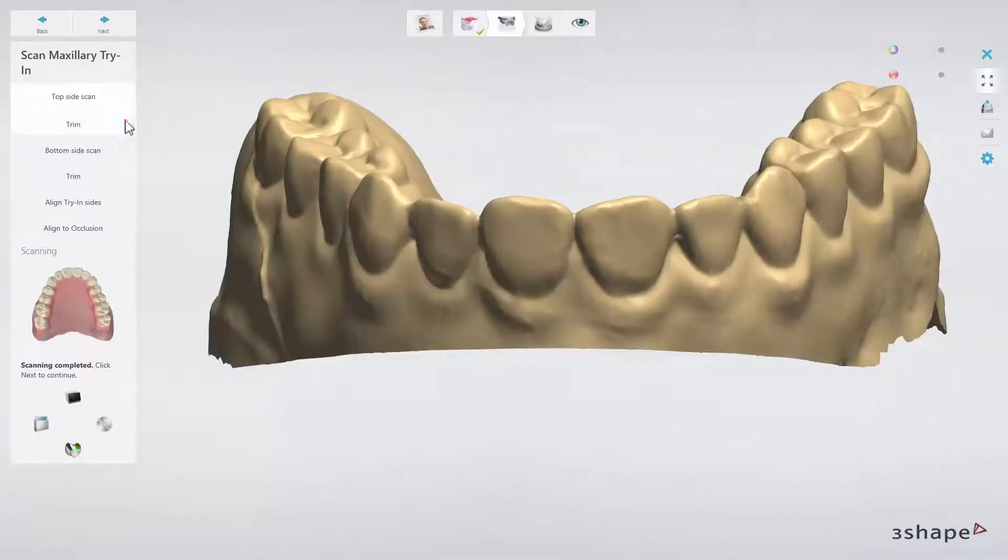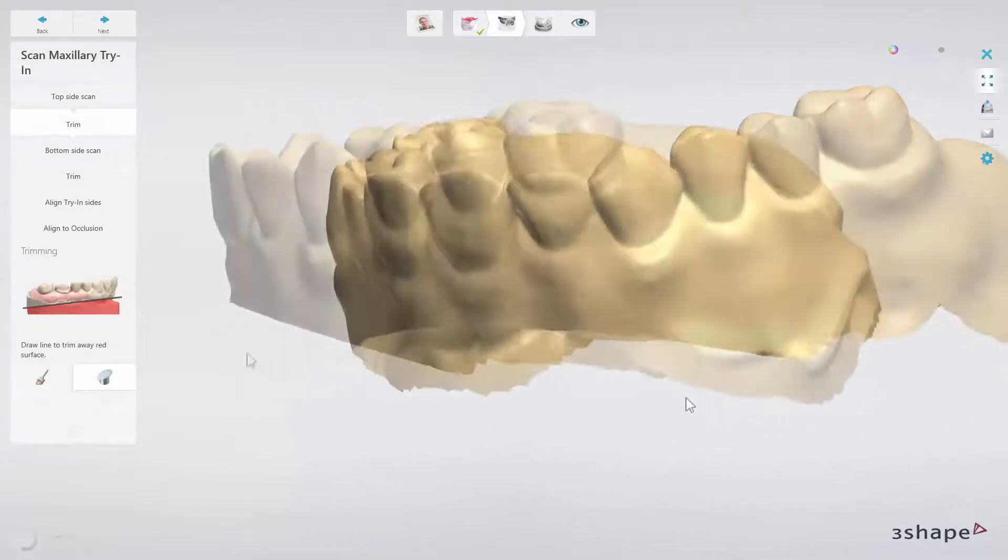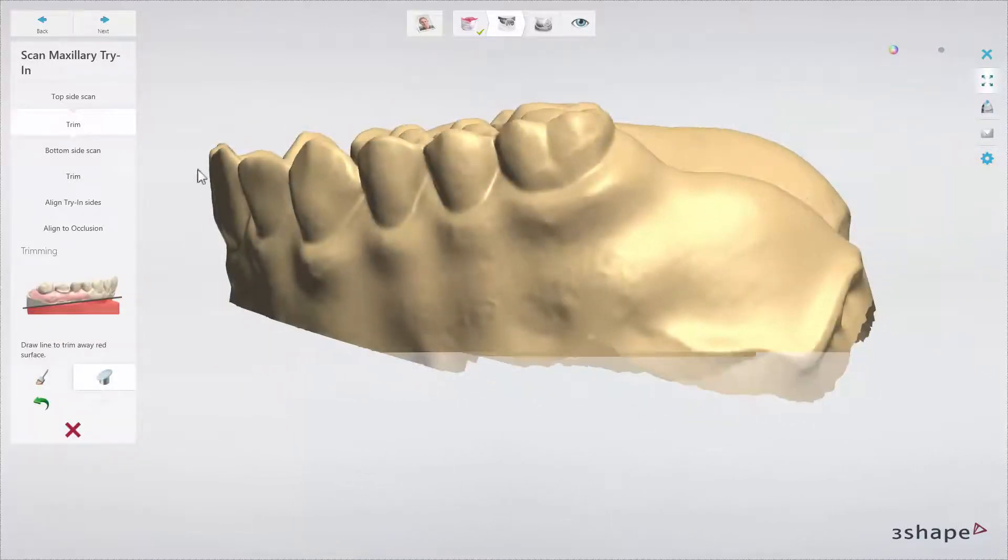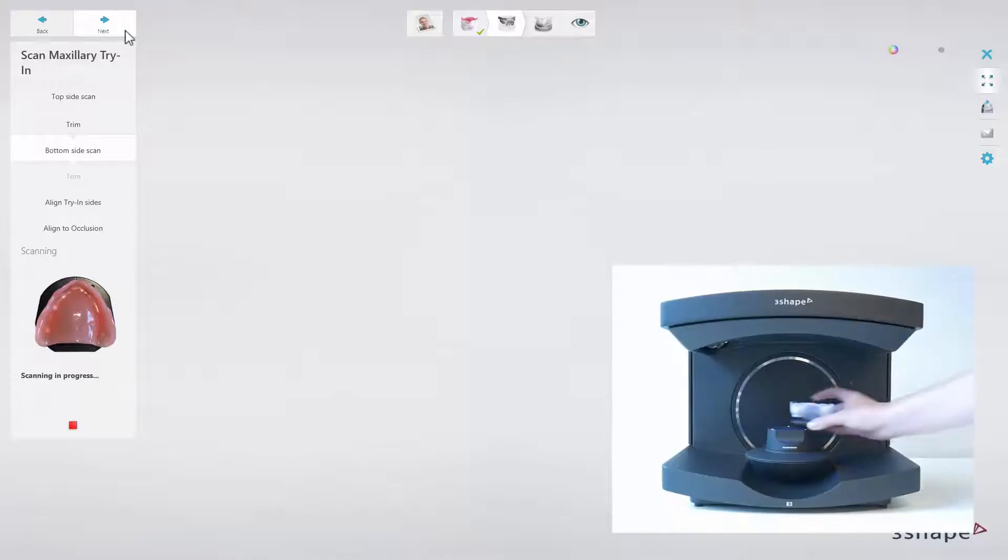When scanned, trim the part of the scan with BluTac using the cutting plane tool. Now flip the try-in denture on the plate and scan its bottom part. Insert the plate in the scanner and scan.